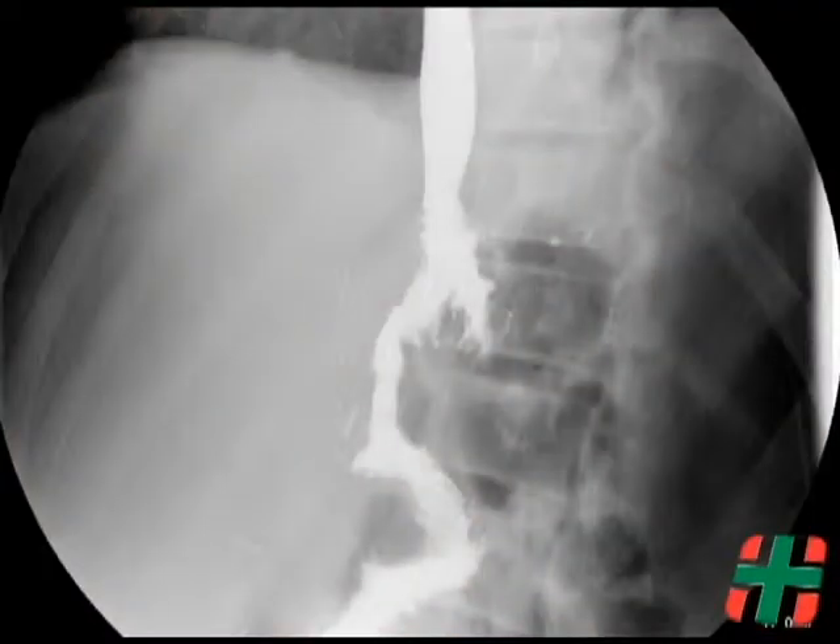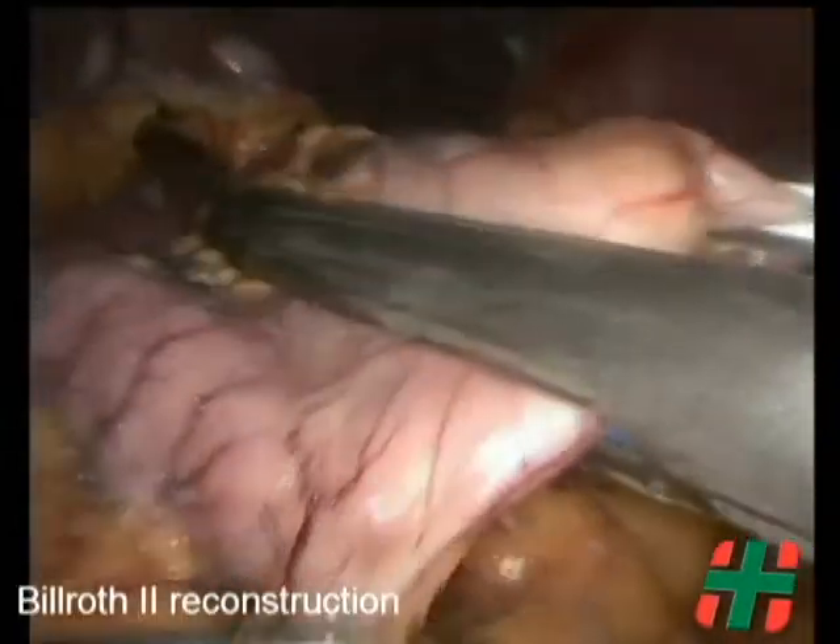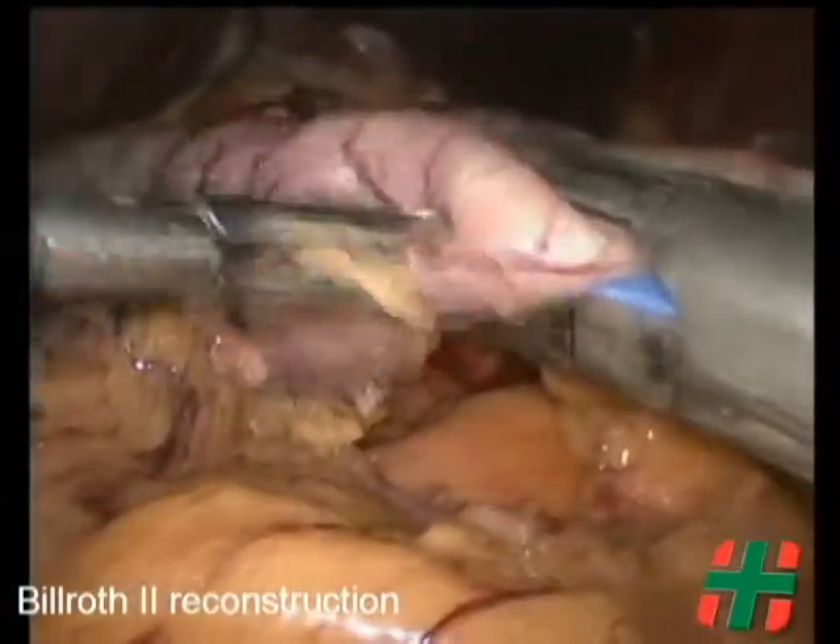In the total gastrectomy case, radiologic control at the 7th postoperative day shows no leaks and a good passage of contrast material. In a subtotal gastrectomy, the stomach is transected using an endoscopic linear stapler, blue load.